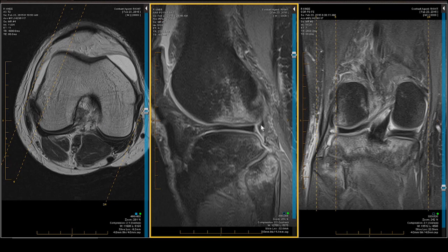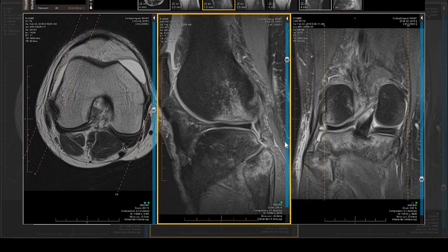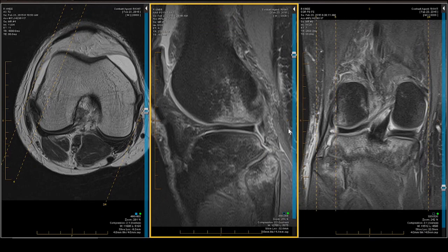There's the popliteus tendon, and there is the popliteofibular ligament — it is swollen, ill-defined, and demonstrates the mermaid sign. Here's our mermaid: there's the body of the mermaid and there is the mermaid's tail. Let me take the overlay away so you can see it, and now I'll blow it up so you can see it even better.